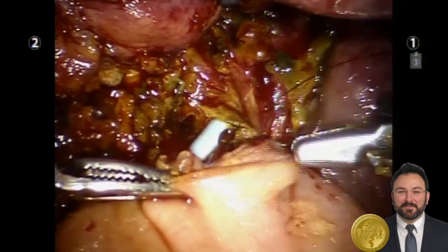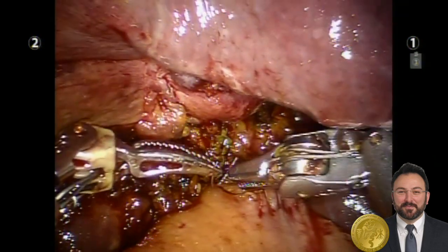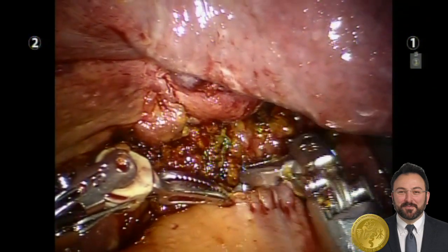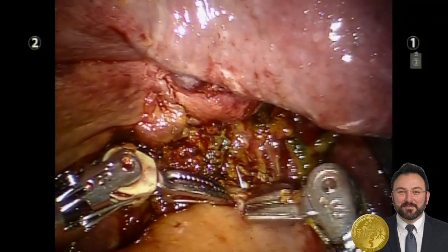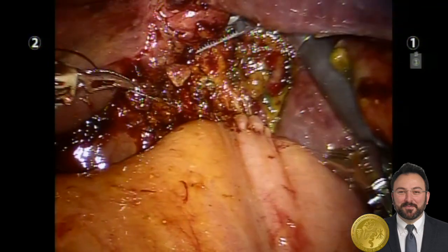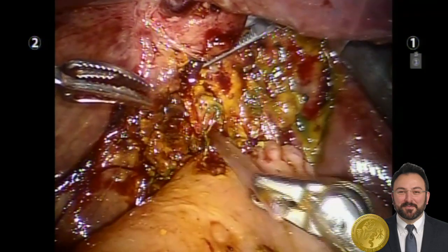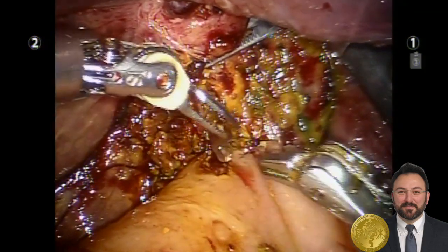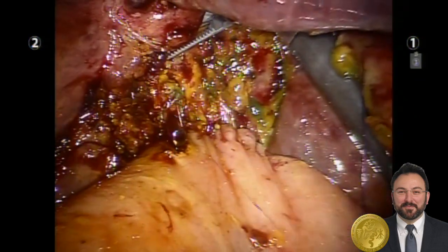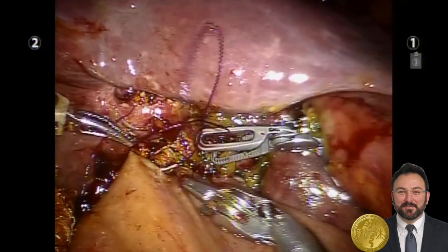The anterior row with 5-0 absorbable suture was then done in a running fashion. Additionally, the right biliary system was sutured closed. Another defect was then noted and cannulated with an 8-French pediatric catheter — presumably the anterior right bile duct — and the anterior layer of that hepaticojejunostomy was also completed in a similar fashion.